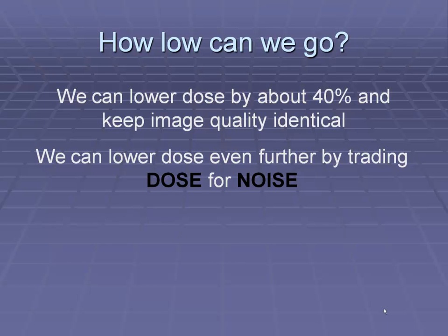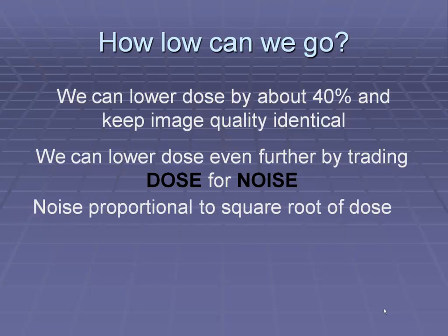There are, however, times when we want to try to go even lower with the radiation dose. And we can do this on all CAT scan images. You're able to lower the radiation dose further, but the trade-off is you get more noise in the image. The noise is basically areas where there's a lack of information on the picture. So if you're doing a CAT scan of the liver, noise will be areas that look kind of staticky, where there's no good information on the liver, versus signal, which is areas of the picture that are preserved and accurately demonstrate the liver.